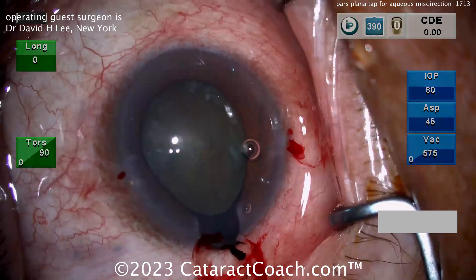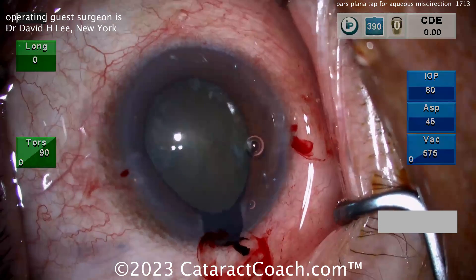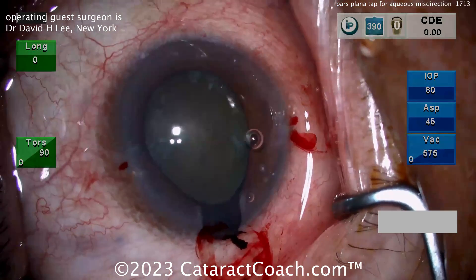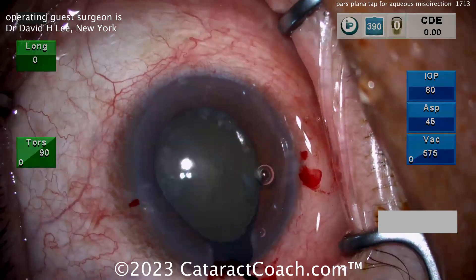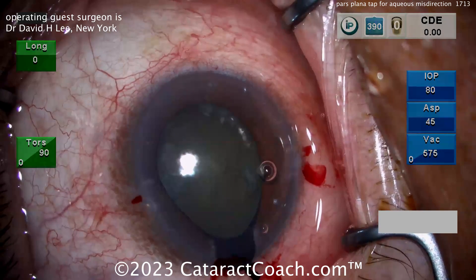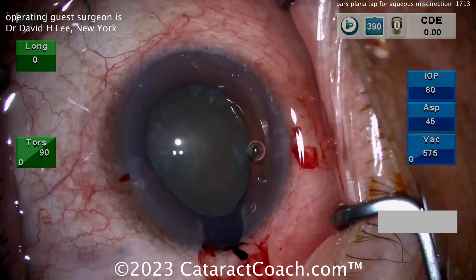The surgeon is thinking about what to do, and I'm really impressed — he does a fantastic job for this case, which is why I really wanted to show you the video despite it not being in true high definition. What he's going to do is perform a pars plana tap — going in with an empty syringe using a small-gauge needle, probably a 25-gauge needle, going into the pars plana and aspirating some of the fluid that's collected. That will resolve the pressure gradient. There's the needle.